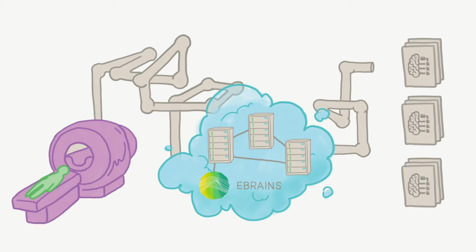The TVB-Brain image processing pipeline extracts structural and functional connectomes from raw MRI data to personalized brain models. The data that is outputted by the pipeline is ready to use in The Virtual Brain. You can conveniently operate the pipeline from the EBRAINS Collaboratory. The computationally heavy work is done using a backend of supercomputers.